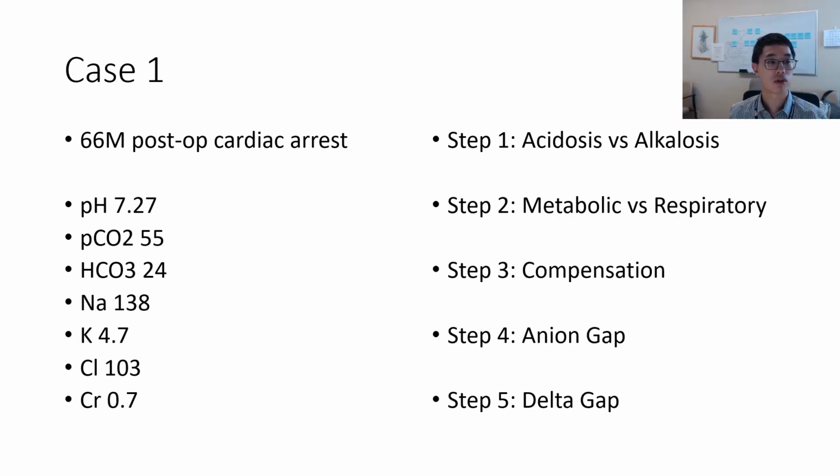We have a 66-year-old male, post-op cardiac arrest. He is coming in with a pH of 7.27, a PCO2 of 55, bicarbonate of 24, and then the chemistry panel is listed here with a sodium of 138, potassium of 4.7, chloride of 103, and a creatinine of 0.7.